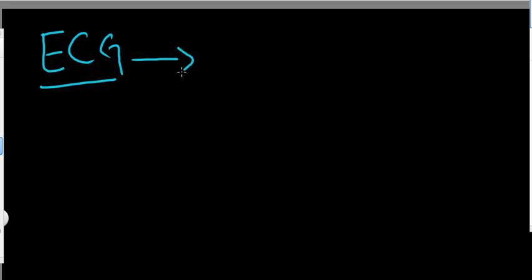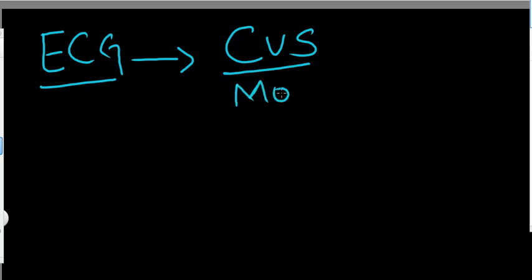I'm Dr. Mas Qureshi and today we are going to learn a few things about ECG, which stands for electrocardiogram. It plays an important role in the CVS or the cardiovascular system module. So first I'm going to teach you how a normal ECG looks like.